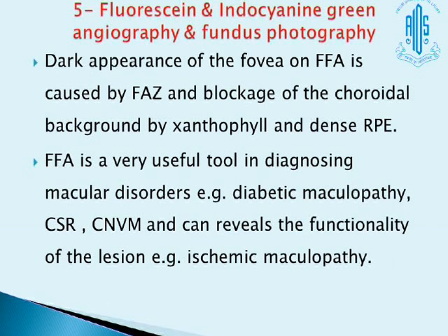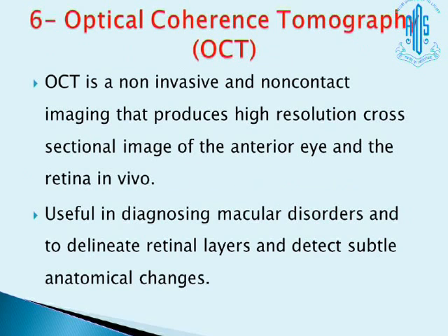Fluorescein angiography and indocyanine green, we are all familiar with them, so there is no aim for discussion now. Now we come to the most important item in my talk, optical coherence tomography, OCT. OCT is a non-invasive and non-contact imaging technique that produces a high-resolution cross-sectional image of the anterior eye and the retina in vivo, useful in diagnosing macular disorders, delineating retinal layers and detecting subtle abnormal changes.